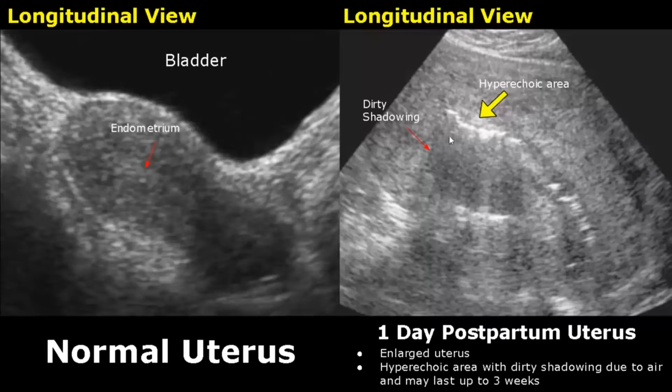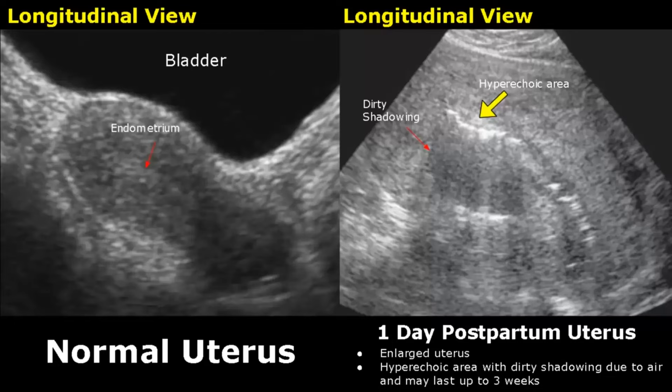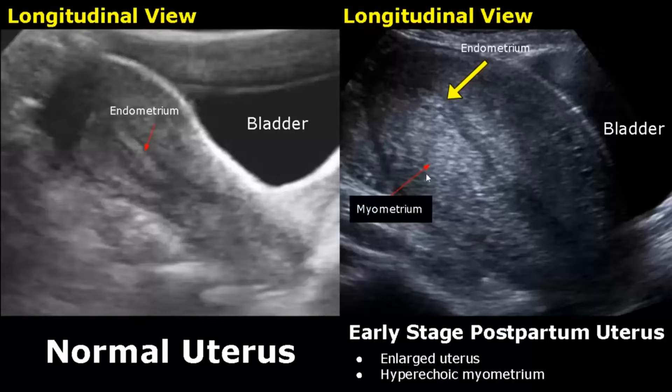Some of these hyperechoic areas are due to blood clots, and some can have dirty posterior shadowing, indicating air present in the endometrial canal. The air may last up to three weeks. These are normal postpartum features. An enlarged uterus is seen in early-stage postpartum uterus, where the inner layer of myometrium can be hyperechoic — another normal postpartum appearance.